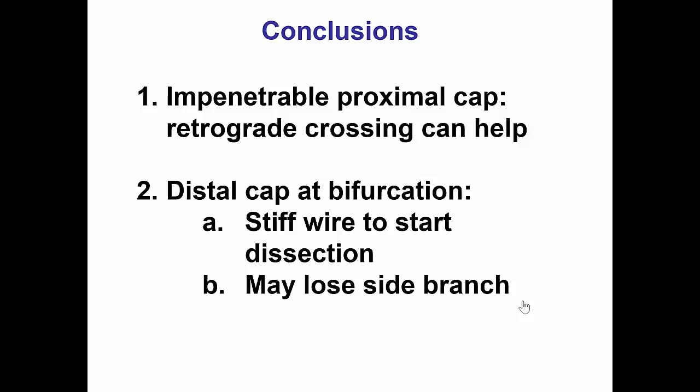Nevertheless, we still lost the side branch of the posterolateral vessel, which remains a risk when there is a bifurcation at the distal cap. This can sometimes be recanalized with further attempts, especially if we have not reached our contrast or radiation limit, but sometimes the side branch may have to remain occluded during the current case and be left for a subsequent crossing attempt in the future. Thank you.